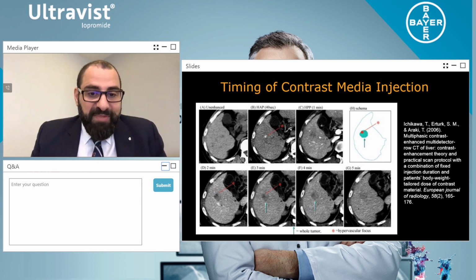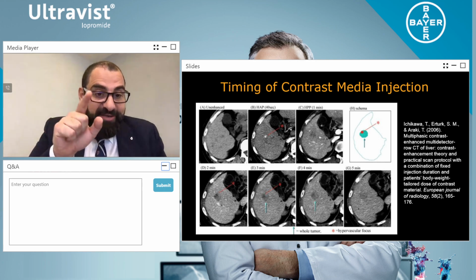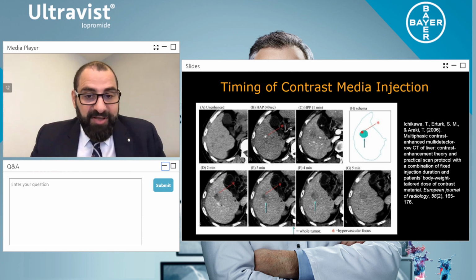If you look at 3 minutes, if you look at the top row here, where we look at 1 minute delayed, okay, of this same lesion, and I actually followed this lesion from arterial phase all the way to 5 minutes. As you can see, the lesion structure in the bottom line actually changes between 2 minutes, 3 minutes, 4 minutes, and 5 minutes. And you see how it's gone from non-well circumscribed to well circumscribed.